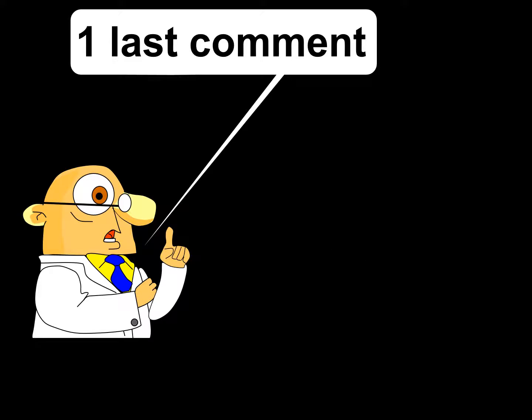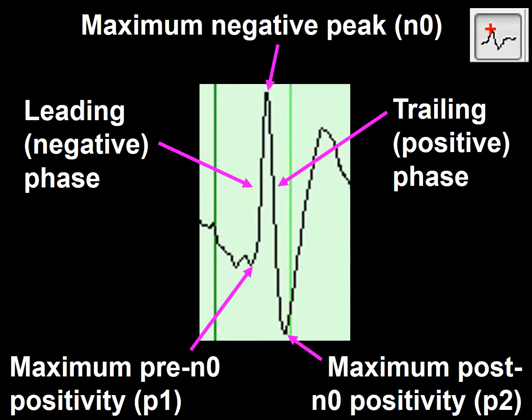The last point I'd like to make in the conversational section of this talk is about describing EEG waves. The reason for this is that most articles in the EEG literature talk about wave configuration, amplitude, and duration without telling us exactly how they went about measuring them. In this frame, I have represented the terminology most often used to name the different components of an EEG wave. Take a few seconds, pause the video if you have to, and look at it.